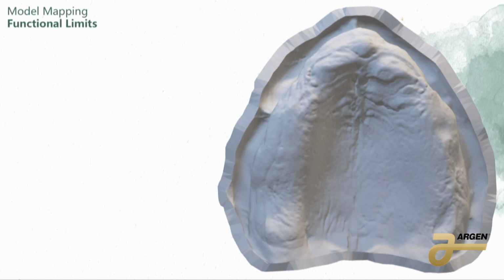If you have a square-shaped ridge, this is really aggressive, but something more square, then the recommendation, which is based off of just looking at hundreds and hundreds of people's teeth and kind of where they sit and the science with the fulcrums. I did not come up with these recommendations. This is from many textbooks.